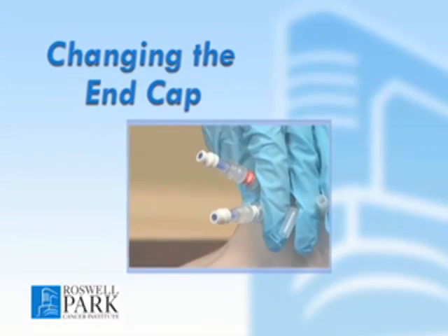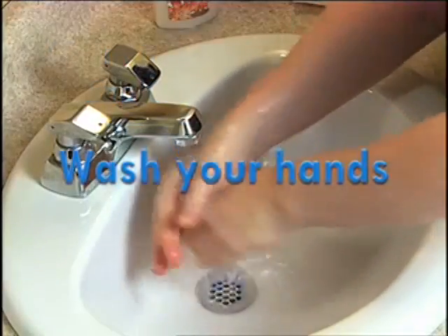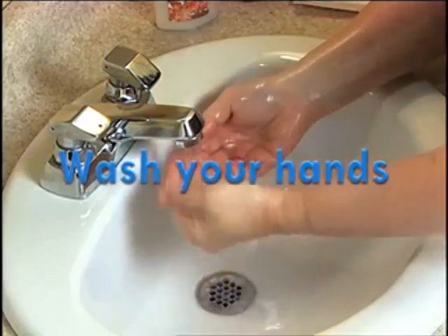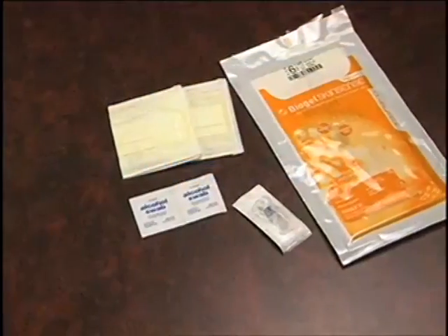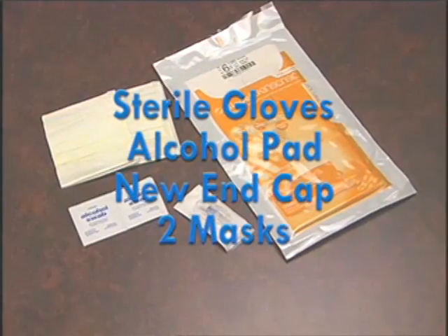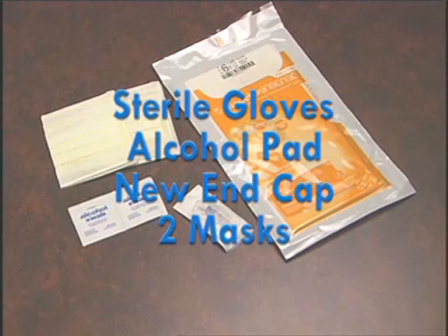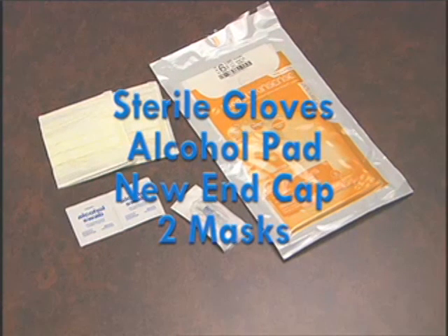Changing the catheter cap. As always, before caring for your line, thoroughly wash and dry your hands. Gather the supplies you will need: sterile gloves, alcohol pad, new end cap, 2 masks.